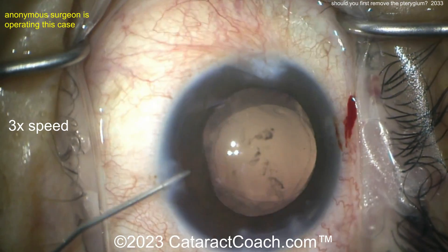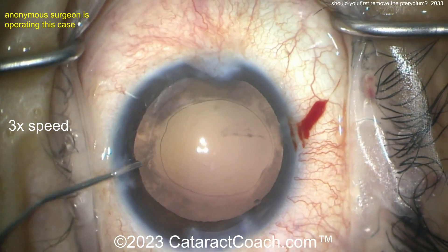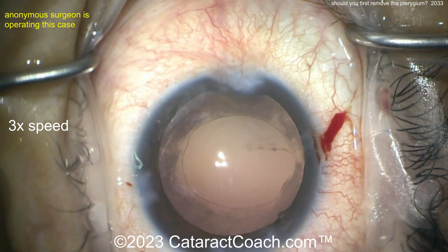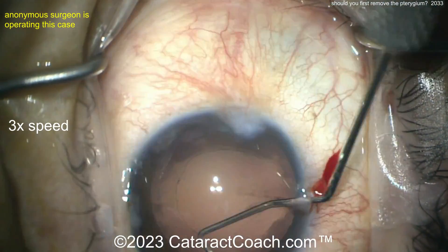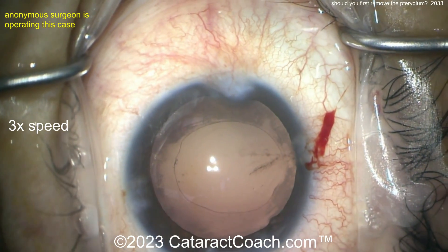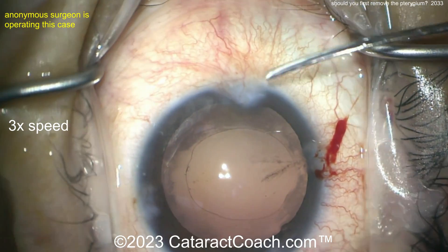Then you ask, how do I do the lens calculations? Simple — remember that myopia is a pretty good thing sometimes, especially a low degree of it. When you do the calculations, look for the lowest K value in the center of that cornea, do the lens calculations from there, and you'll choose a slightly higher IOL power. The patient will end up emmetropic to slightly myopic, which is a pretty good outcome.